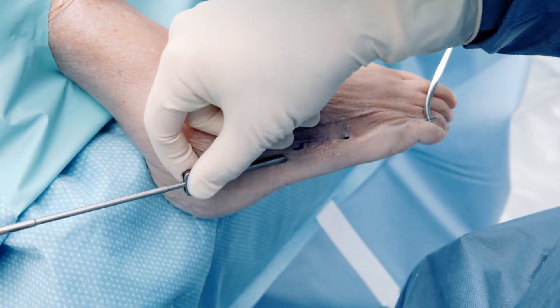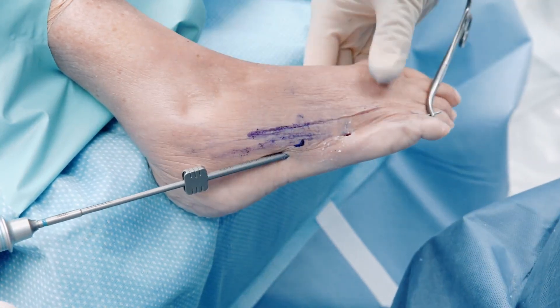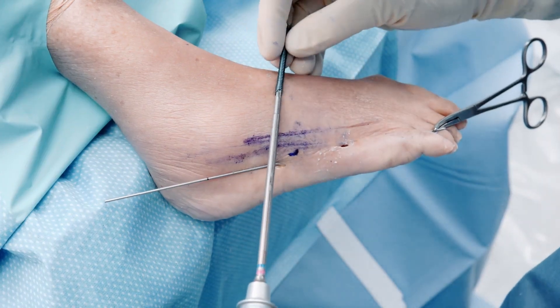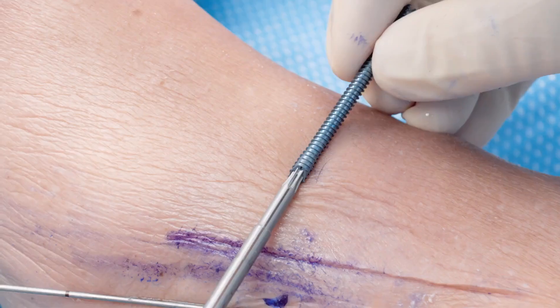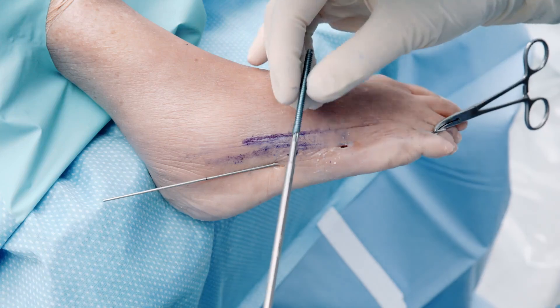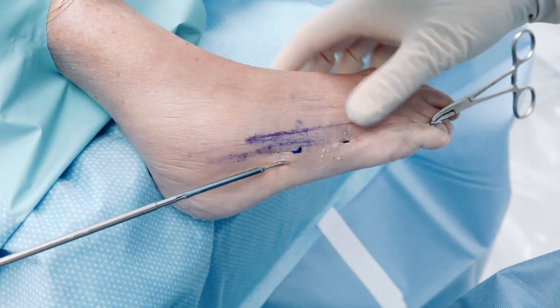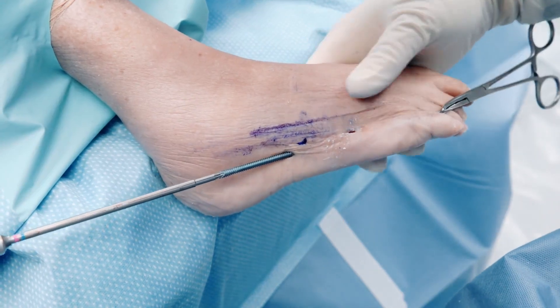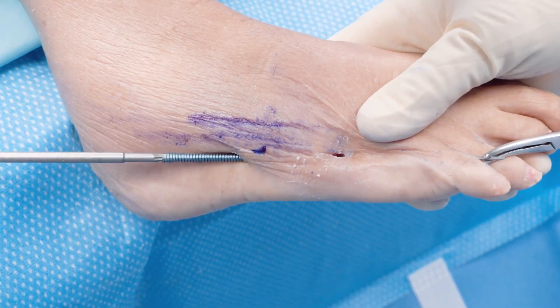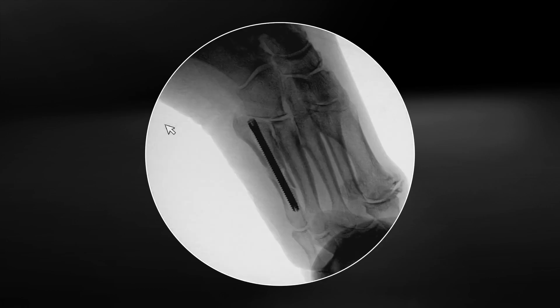We're going to drill over this under fluoro, not necessarily wanting to go through the medial cortex. If we line up the laser line on the drill with the laser line on the screw, we know what side the bevel is going to be on once the screw is buried in the soft tissue — it's just a little visual guide. It only works as long as you keep the driver engaged on the screw; once the driver is no longer engaged, you'll have to do it with fluoro. There's our final fixation and our final correction in the AP plane, and there's the lateral.